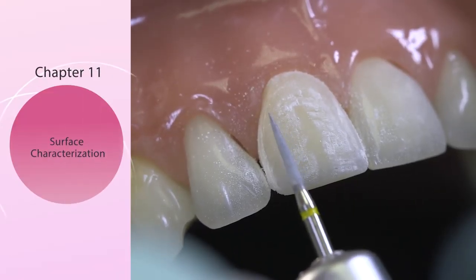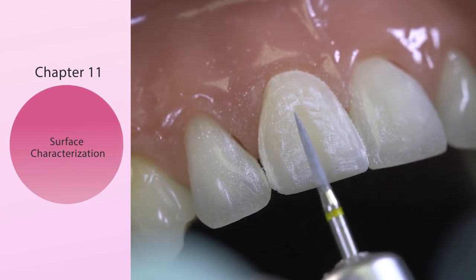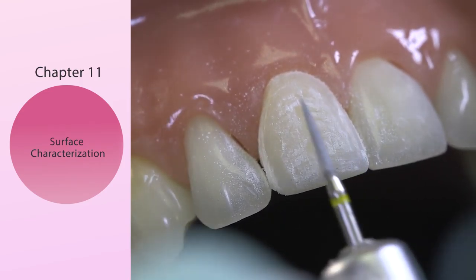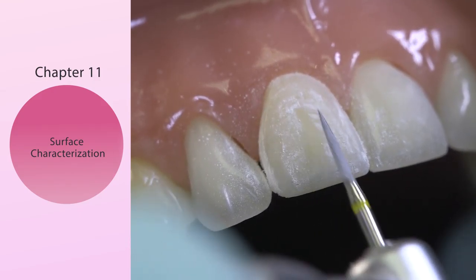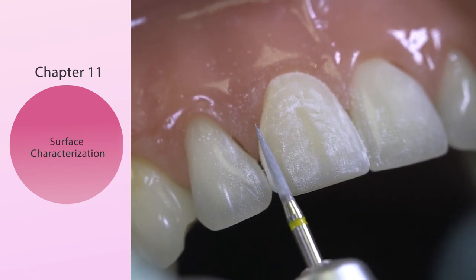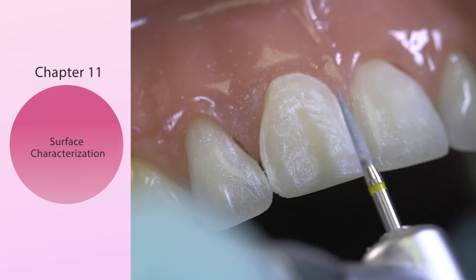To add a little bit more characterization, I've taken from the Artistic Bur Kit the Yellow Flame Diamond again — one of my favorites. Adjacent to the height of contour, we could put two concavities adjacent to this. So the final surface contour will have: high contour, concavity, high contour, concavity, high contour.